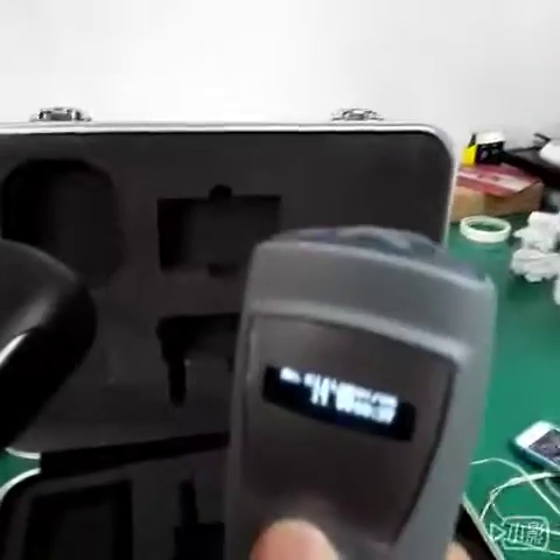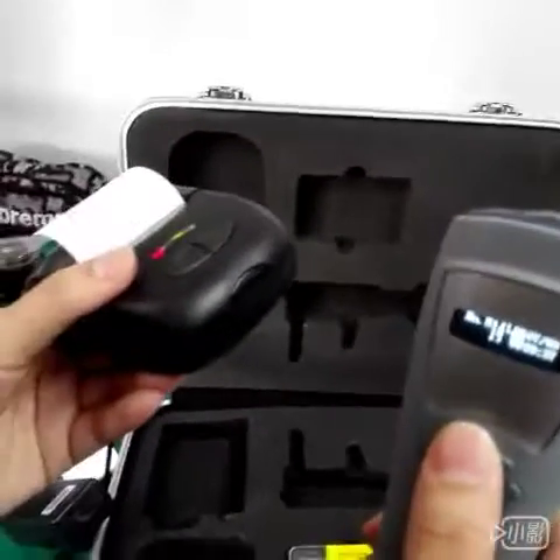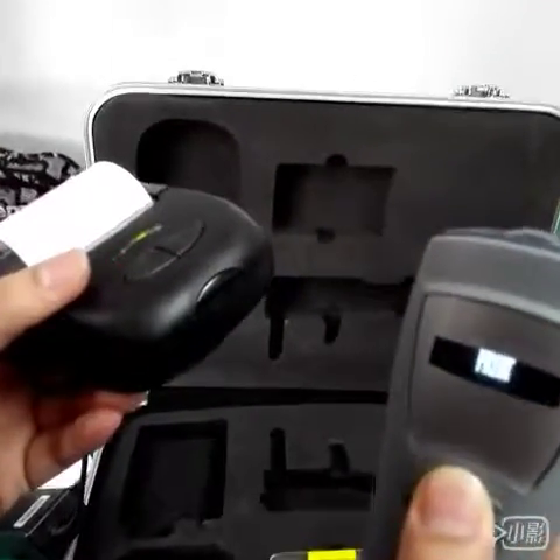Now we need to long press the enter button, and then it can print out automatically. It's very easy to operate. Now we're ready.